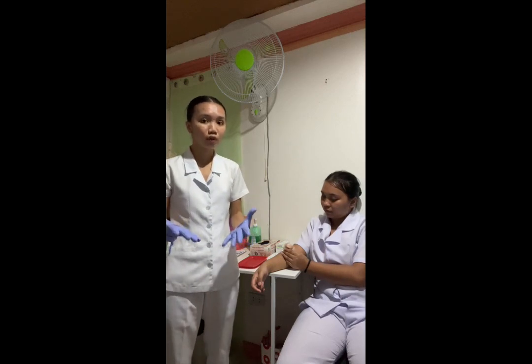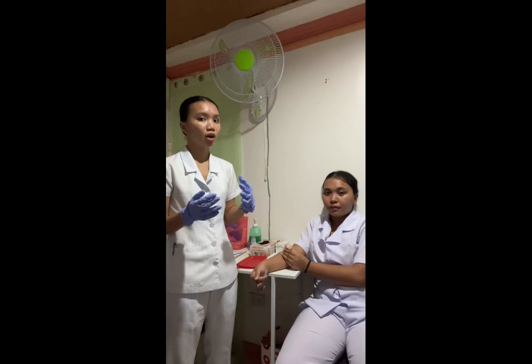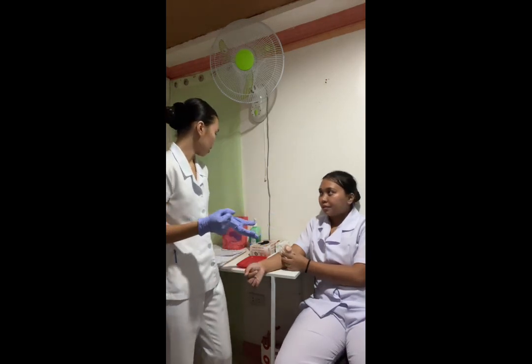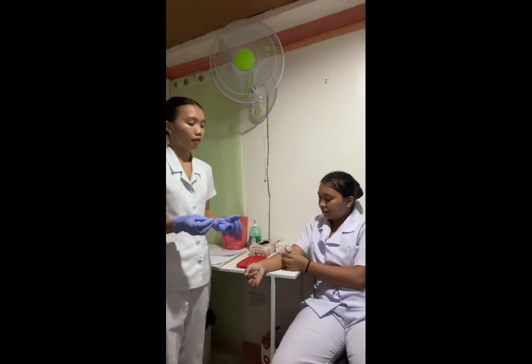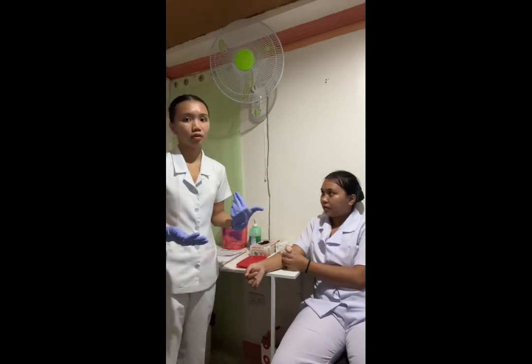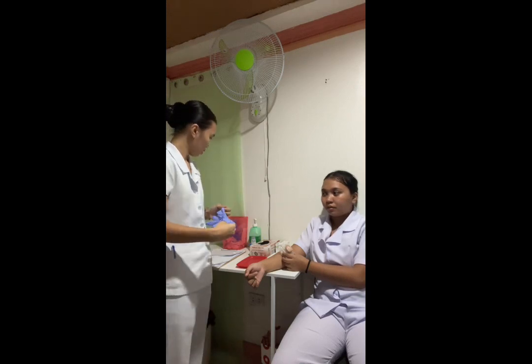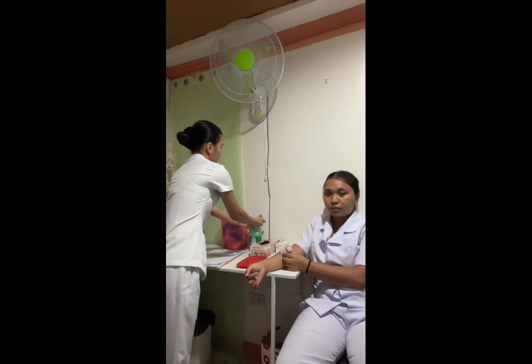And then we have to remove and discard gloves. We should not recap the needle in order to prevent needle stick injuries. So that's why after I remove the syringe from the skin, I already discard it afterwards. And then we have to remove our gloves since we are done, and then discard them. Then perform hand hygiene, to prevent any cross-contamination and also to protect ourselves.